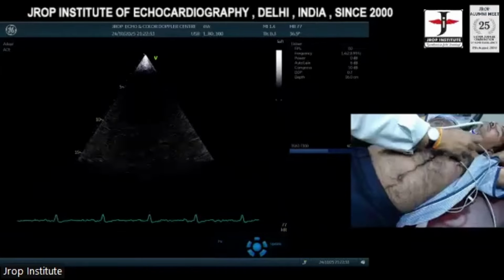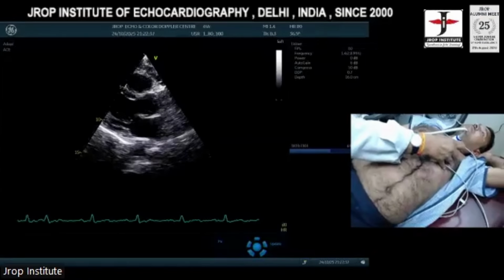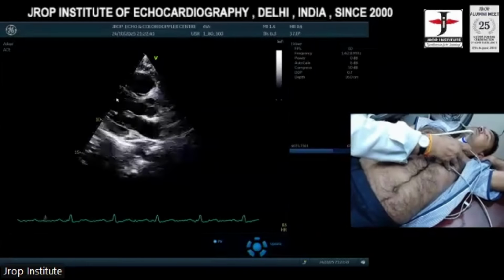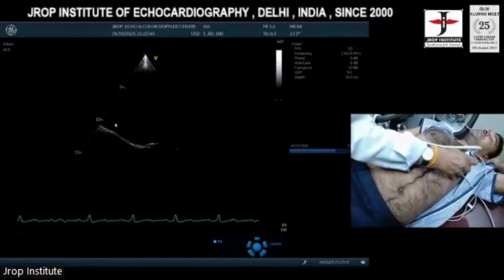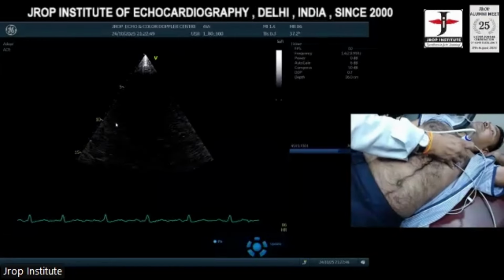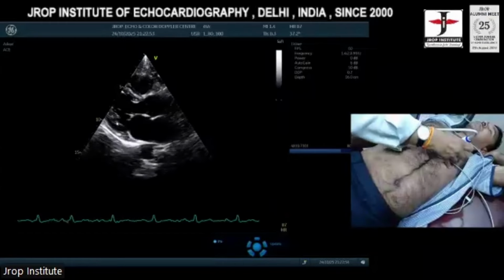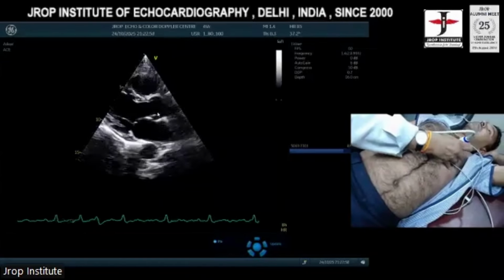The parasternal window is when the aorta is horizontal, and we only see the basal anterior septum and basal posterior wall. You should see only the basal anterior septum and basal posterior wall. Not this one, this is the apical long axis view. We should see only this, just close to the sternum. And look here, both leaflets, right coronary and non-coronary cusps, are equally opening.